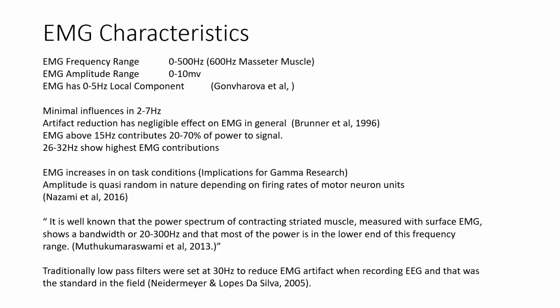And that's why Herschel Tumum used to always say to me, well, EMG is in the millivolt range. He's a PhD in electronics, but I would talk to other people, I won't mention their names, and they would say, oh no, it's in the microvolt range, and they would be adamant about it. I'm siding with Herschel, who's got a history of engineering accomplishments and a PhD in our field. And Herschel showed me the schematics and his measurements and everything. That's science.